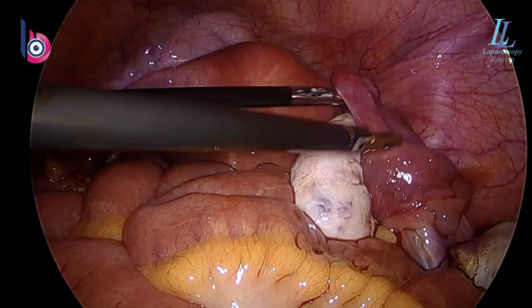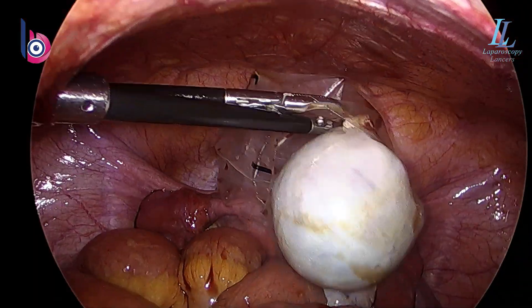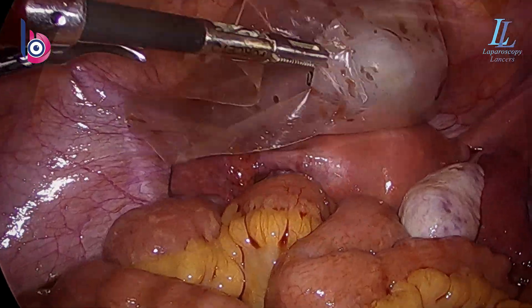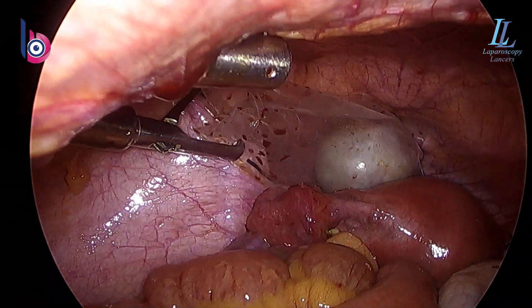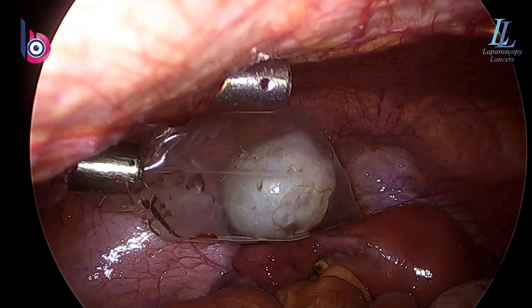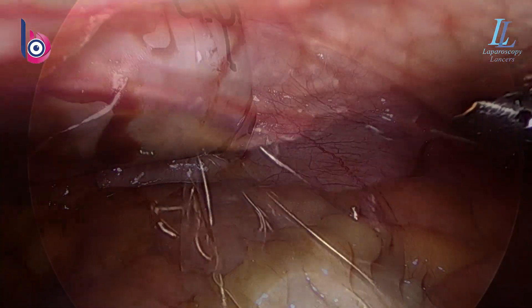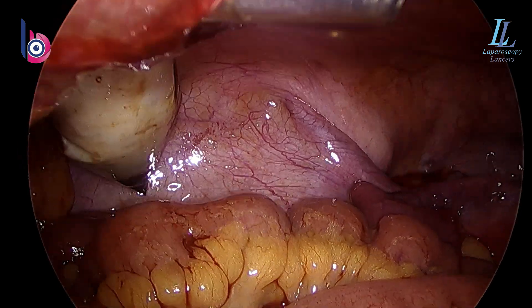So the surgery is complete. Now we'll be taking out the specimen in an improvised endo bag. Here you can see a plastic endo bag, autoclaved, with high tensile strength — you can guess what it was before we changed it into an endo bag. Please do comment on what types of endo bags you use. Obviously a glove finger can't be used for this — very high tensile strength is needed so this dermoid should not rupture inside the abdomen.